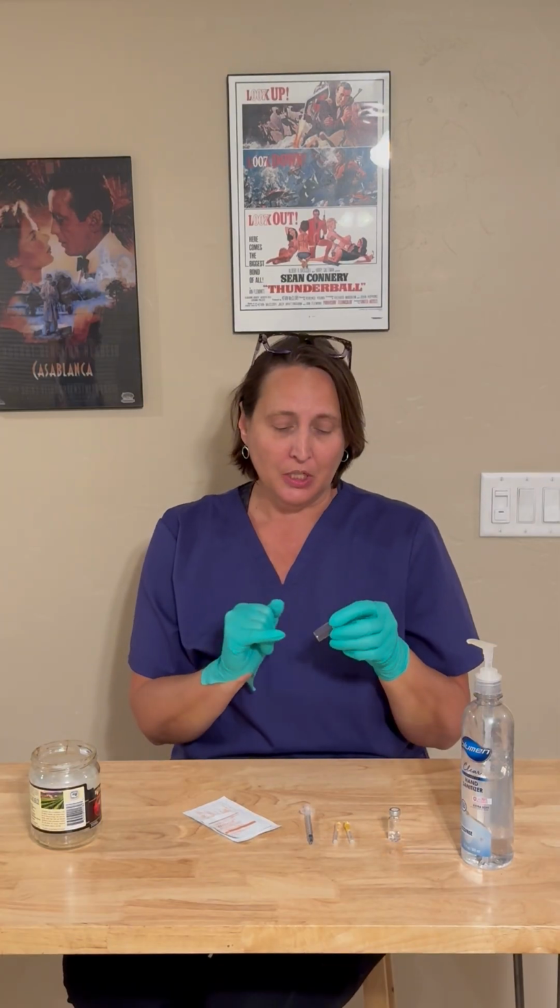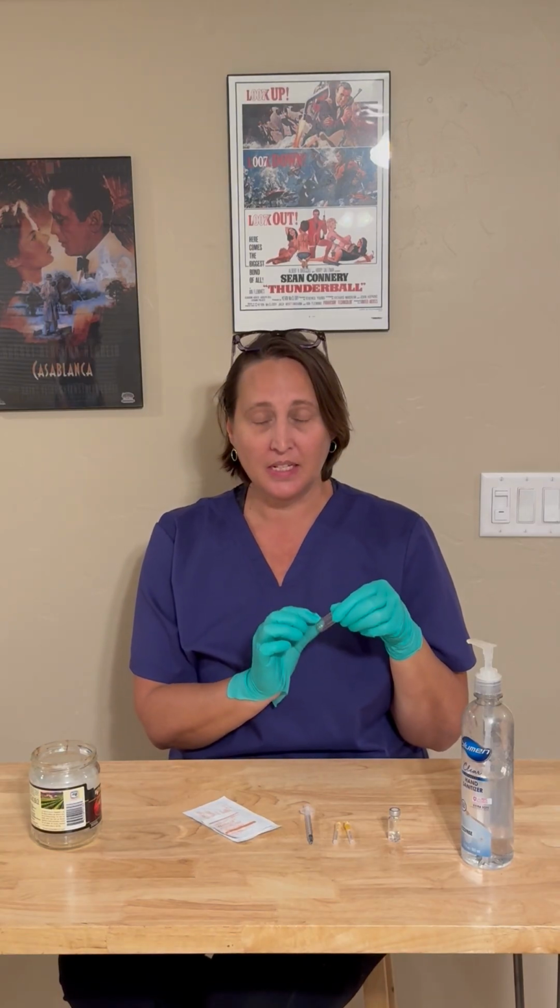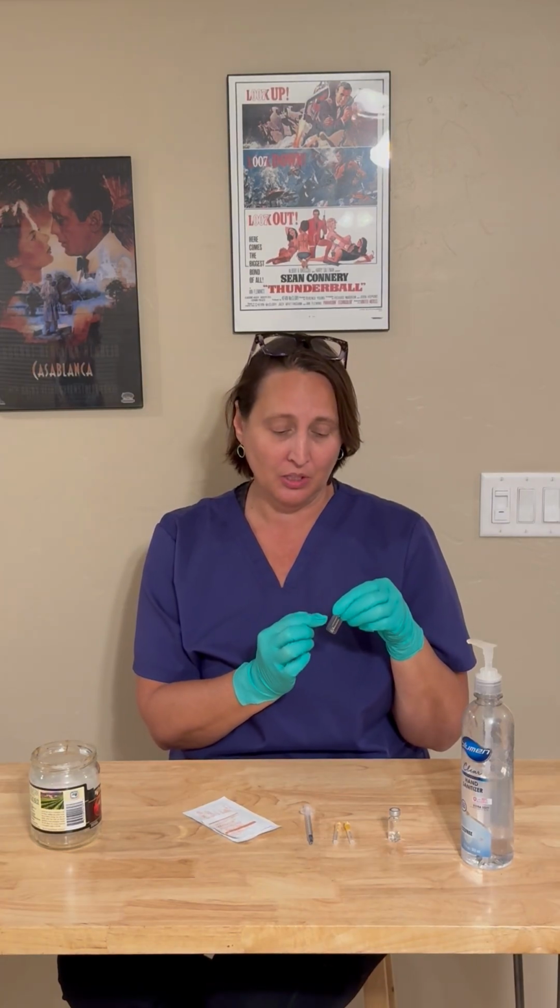The first most crucial step to withdrawing a medication is verifying your medication. This is not labeled, but we're going to go ahead and pretend. You'll need to verify the name of the medication, heparin, and the concentration. In this case we're going to use a 10,000 unit vial, so 10,000 units of heparin per 1 milliliter in this vial.